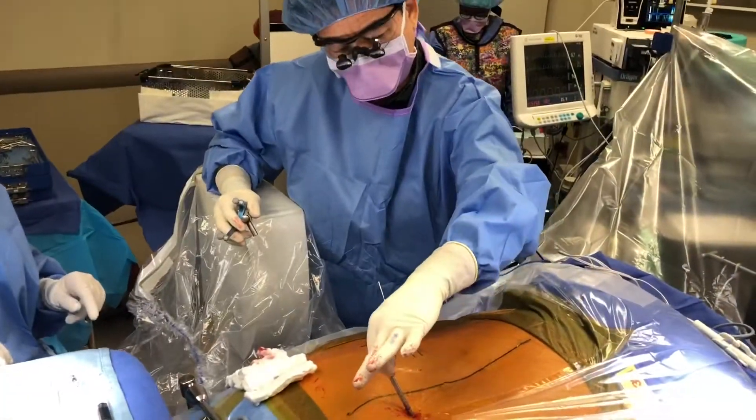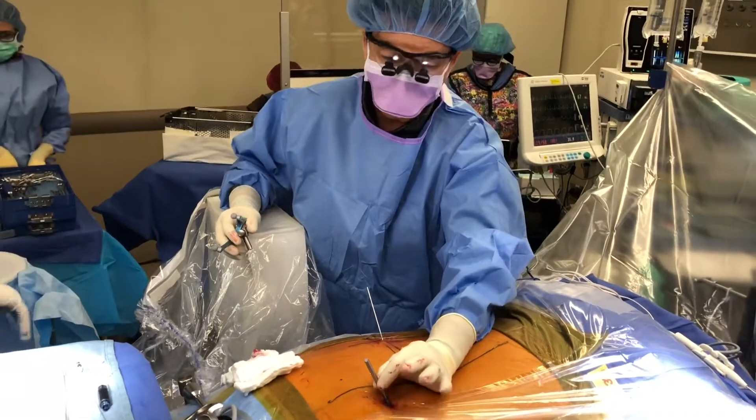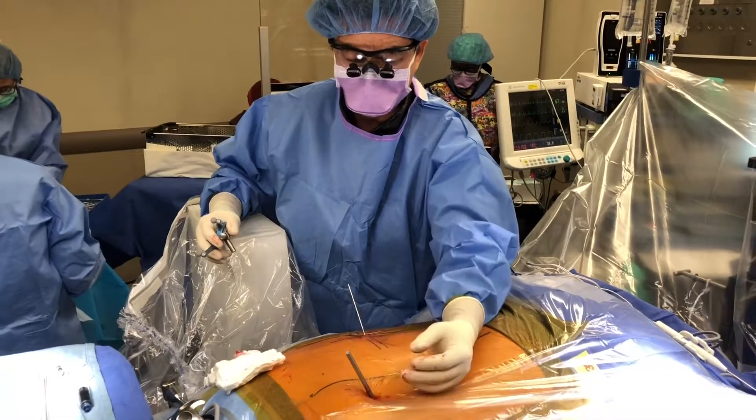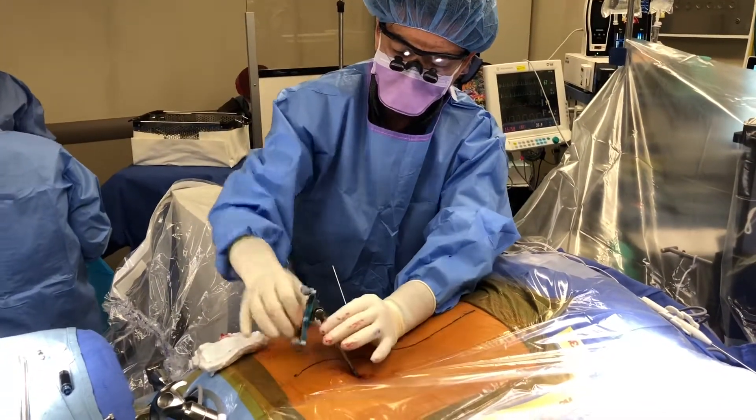This is the patient reference pin. This one's in the posterior superior iliac spine, which is the pelvis. It's vitally important that this is in really good bone, and when you wiggle it around, you can just tell it's rock solid. Then you put the navigation flight on the patient reference pin.